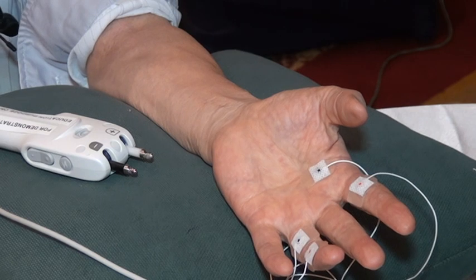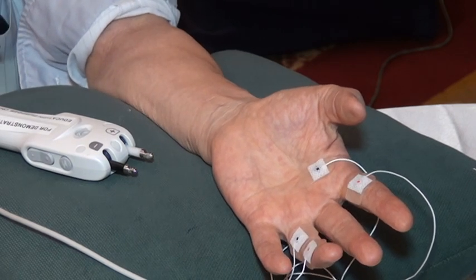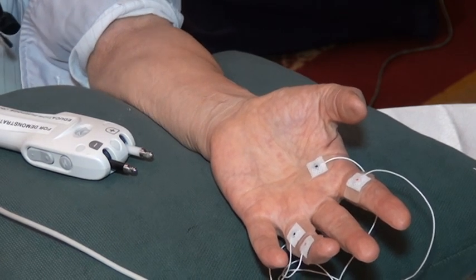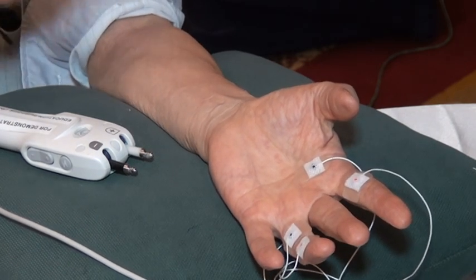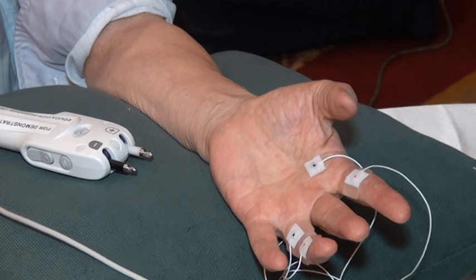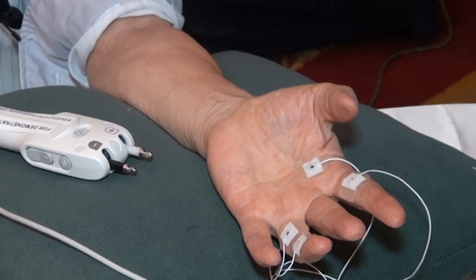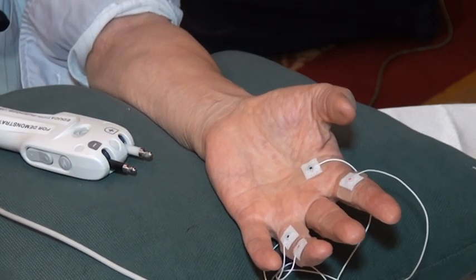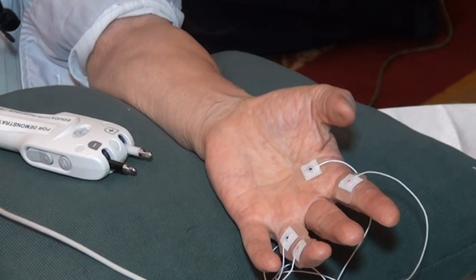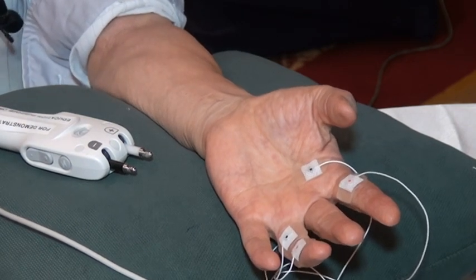There's a lot of debate about what this is, but it is related to the nerve action potential before it enters the muscle. And this is very complicated. I know exactly what it is, but I don't want to tell you because it takes a lot of talking. But I think it's important to ignore that when you're doing a clinical study, okay? Its name is premotor potential, and it is not part of the motor potential.